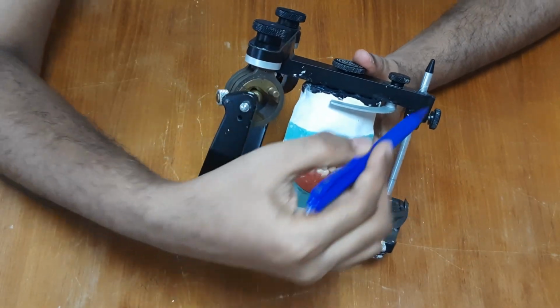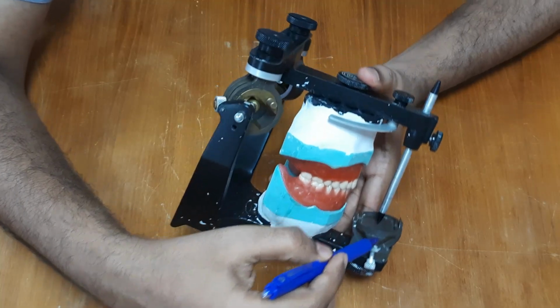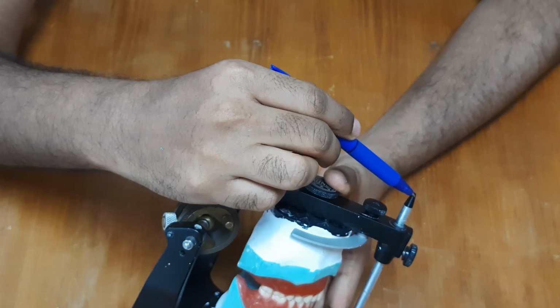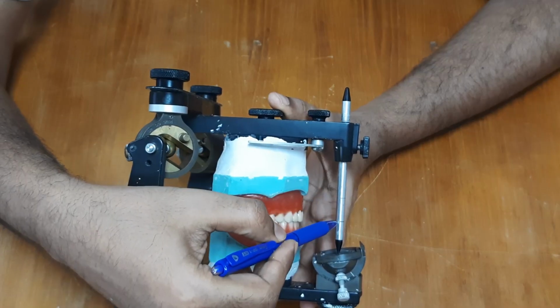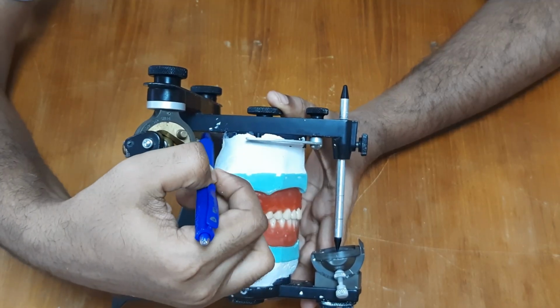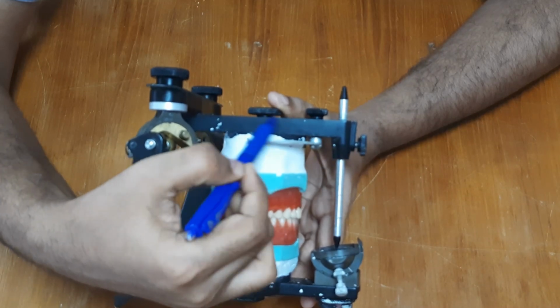The incisal pin has two ends, a chisel end which is usually used with the adjustable guide table, and a rounded end which is used with a customizable incisal guide table. There are two markings on the other end of the incisal pin. One marking is 37 millimeters from the Frankfurt horizontal plane, and the other is 54 millimeters away from the Frankfurt horizontal plane.